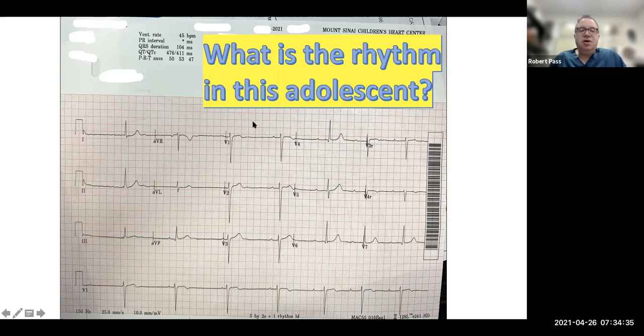And Rachel Moss is asking, would you be worried about this patient's ability to compensate with exercise, and would we want an exercise stress test? The answer is maybe, but we could also do a poor man's stress test and just ask the patient while wearing the Holter or the Zio patch to exercise to see what happens to conduction, which is what we did. And so you really want to make sure that this is as bad as it gets.